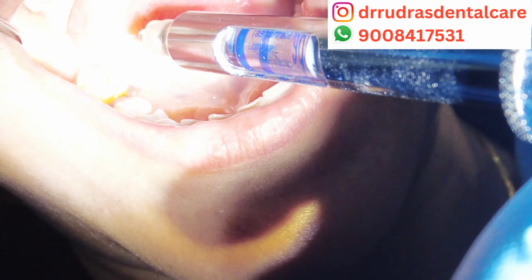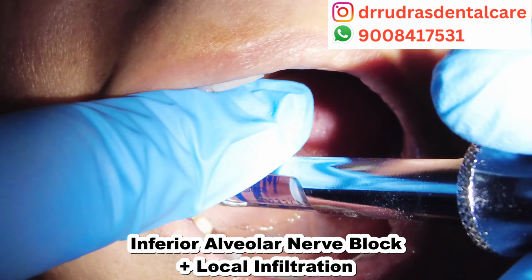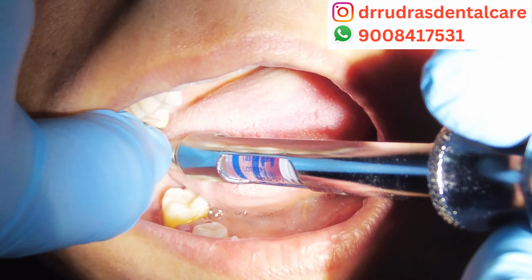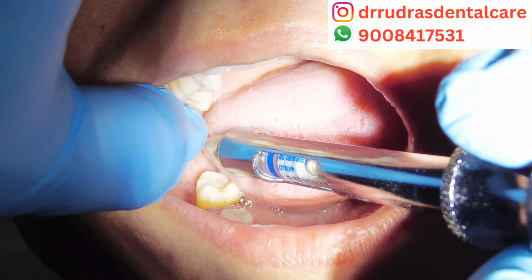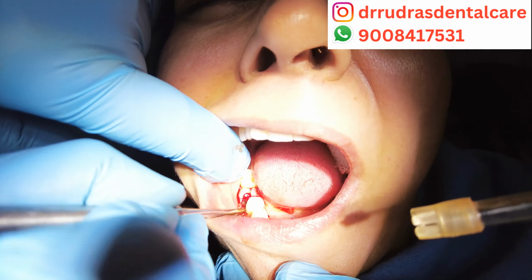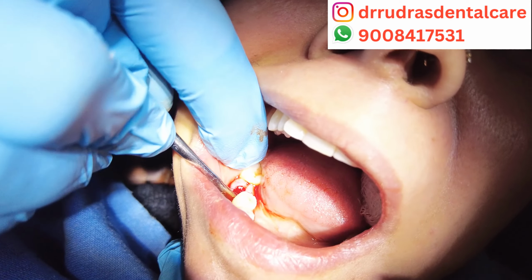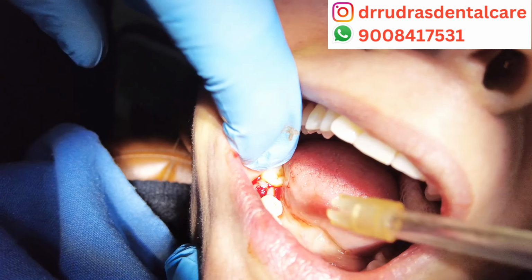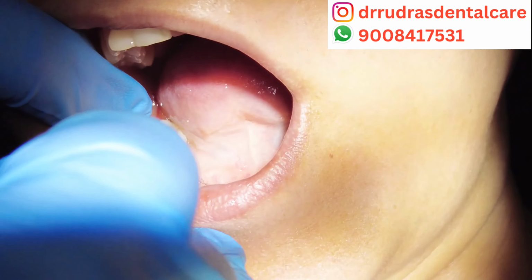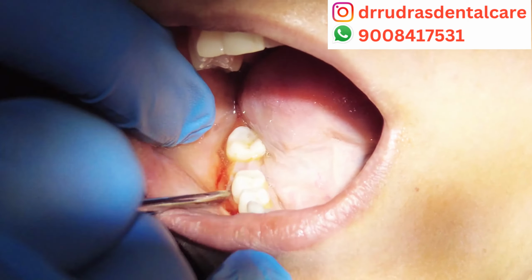Here you can see we are giving the inferior alveolar nerve block and some field block infiltrations so that we can anesthetize the tooth and the patient can be comfortable during the procedure. Mind you, during the procedure the patient does not feel any pain, the patient just feels pressure and movements, but in anxious patients even pressure feels like pain, and also sometimes in patients who have infectious teeth or infected teeth, the anesthesia might not work.